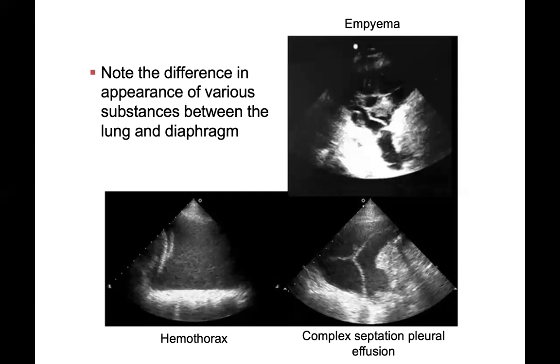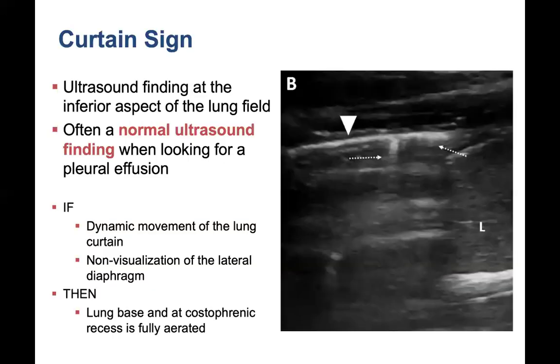This can be important too for diagnosis, of course, and management, because if it's just a basic pleural effusion and it's bilateral, I might just be diuresing the patient. Versus if there's adhesions, then I'm more likely to place a chest tube because they're going to need potential tPA, DNase, or other interventions.